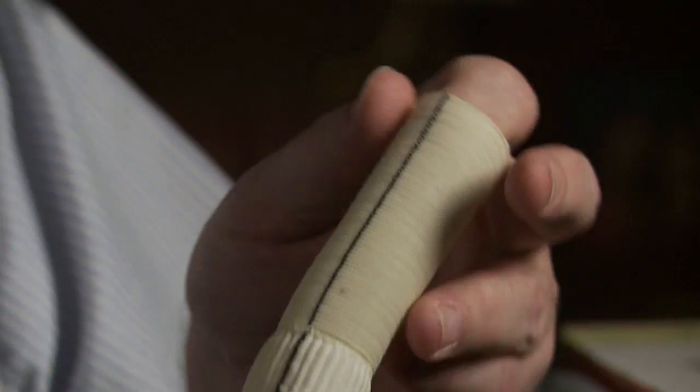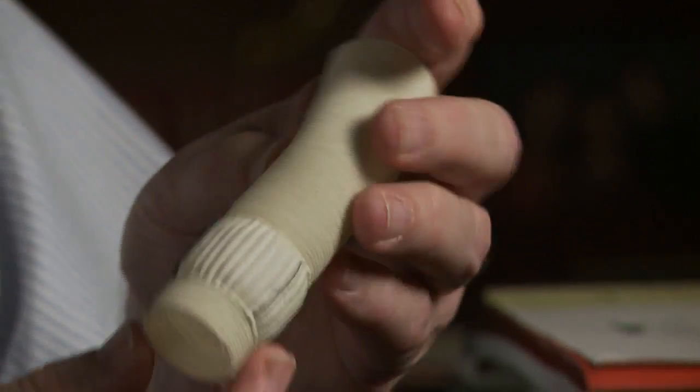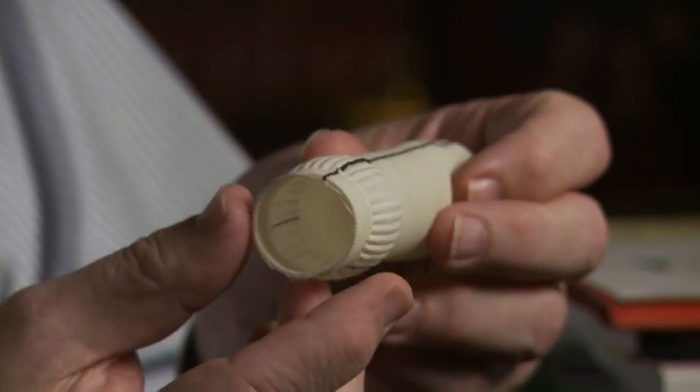This is the type of Dacron graft that we use for this operation. It's about the size of a normal aorta. This little bulge area here is where the valve is sewn in. So this replaces the aorta — we don't wrap the aorta, we actually remove the aorta and replace it with this.